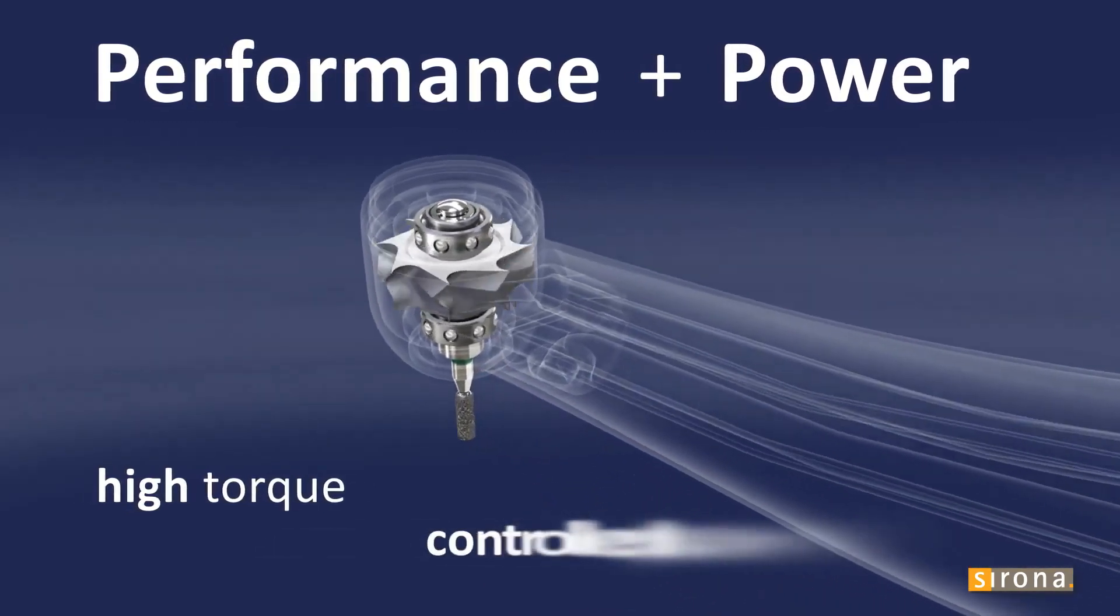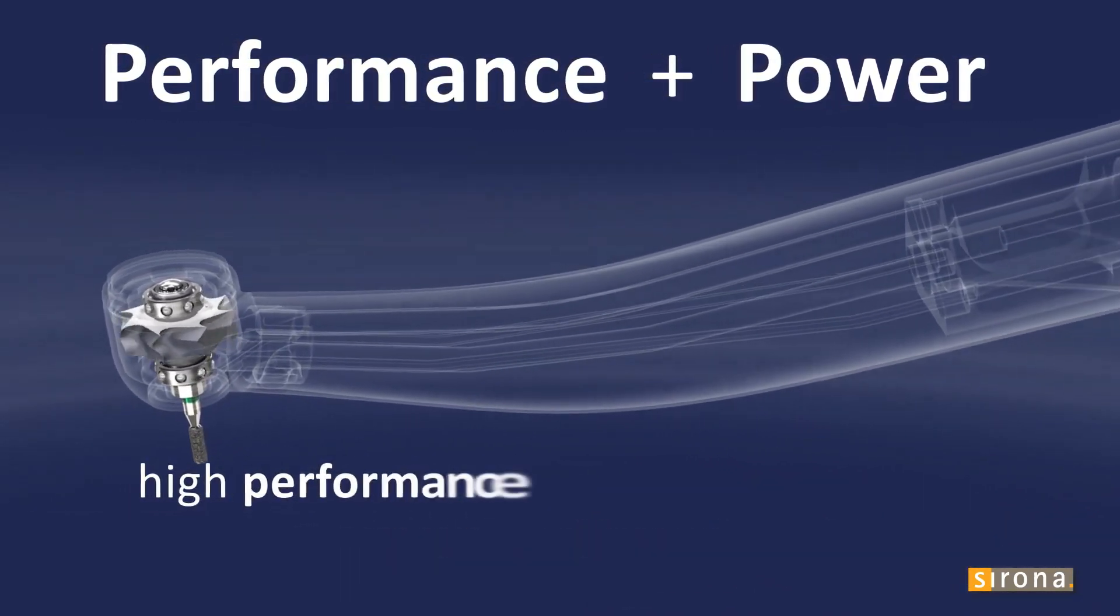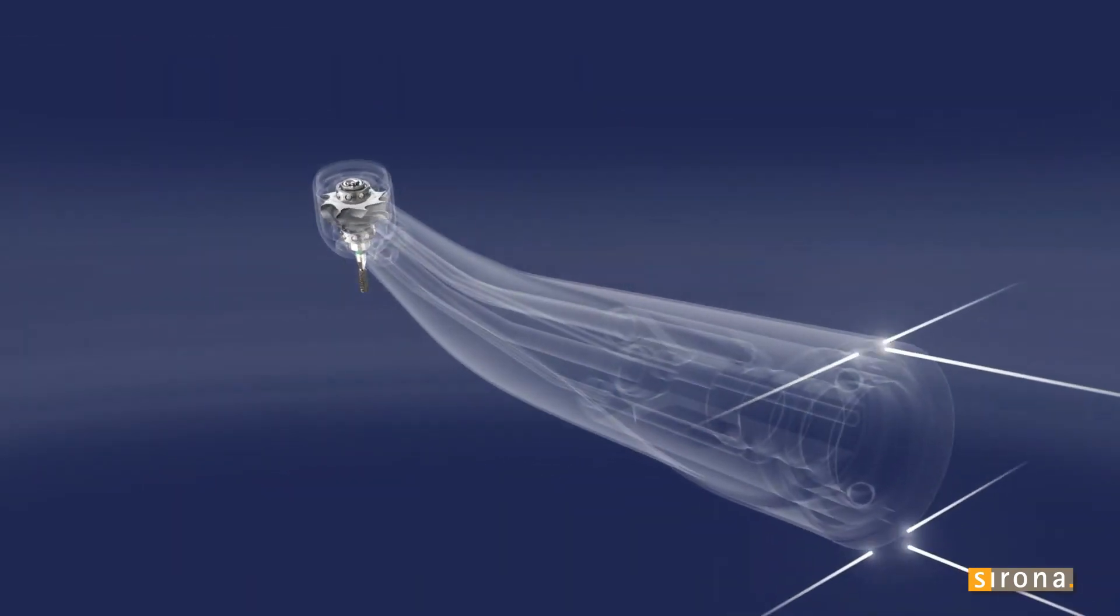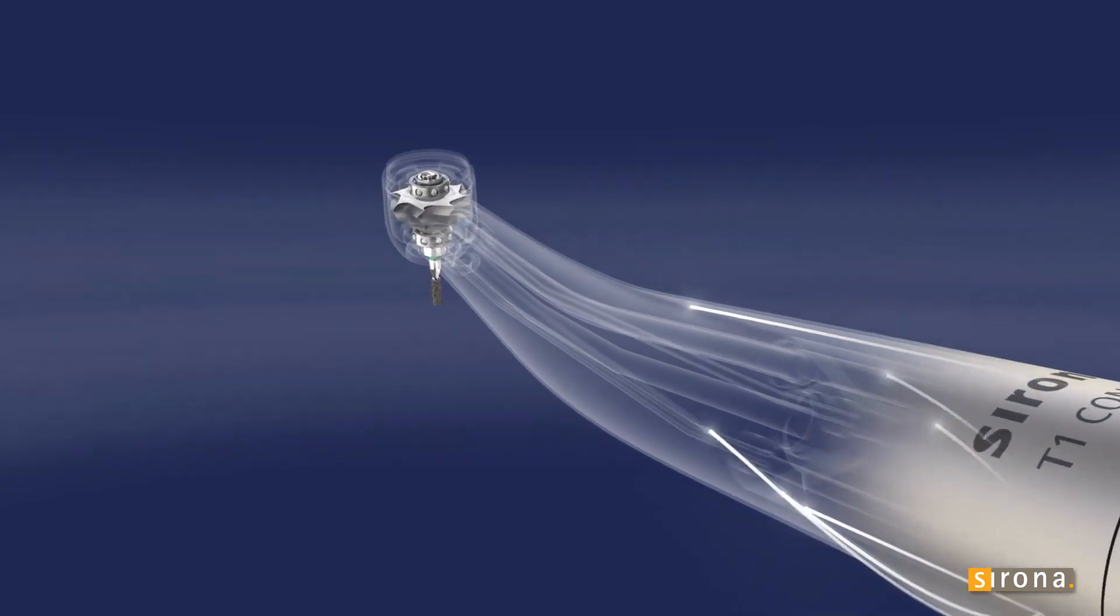There are handpieces with ratios of 5 to 1, 8 to 1, 10 to 1, and even 20 to 1, each with a speed that is ideal for dental procedures where more torque is required, such as endodontic and surgical procedures.